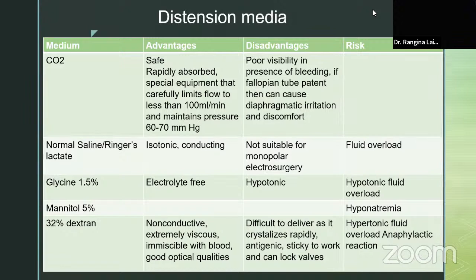Talking about the distension media, nowadays I use normal saline. We are not using monopolar nowadays. All of us know about the glycine in monopolar, with high chances of hypotonic fluid overload.